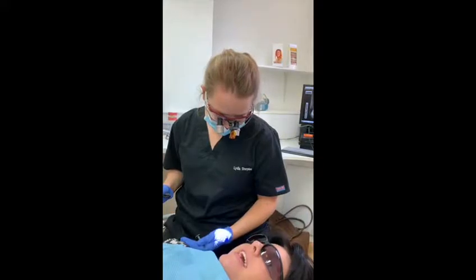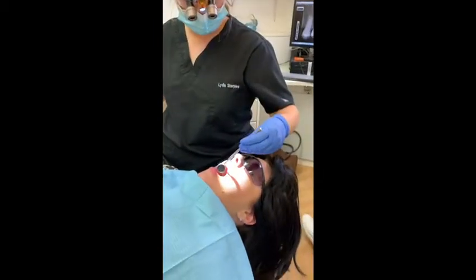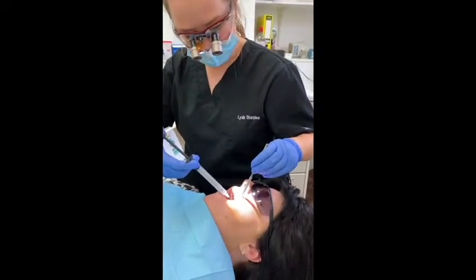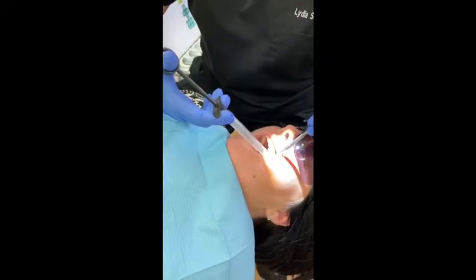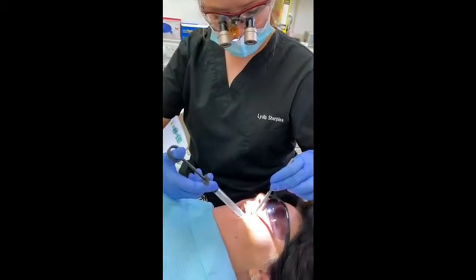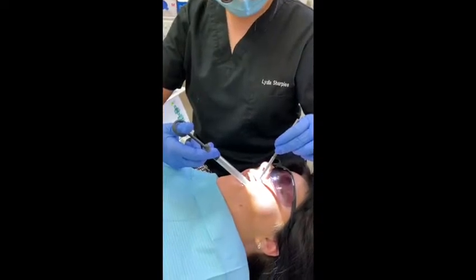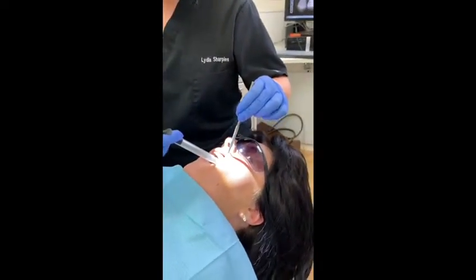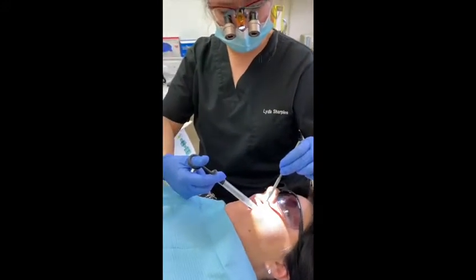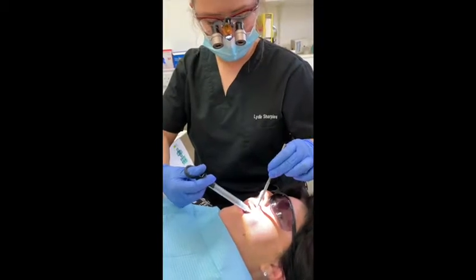So Amy, are you happy for me to pop this anaesthetic in for you? Absolutely. Are you comfortable? I am very comfortable. Brilliant. If you can open nice and wide and tip your head slightly towards me — that's great. Take a really nice deep breath in for me, and out. Well done Amy, that's really good. Take another nice deep breath in, and out. Take another nice deep breath and this time when you breathe out, really relax into the chair. That's great. Well done. Relax those shoulders for me. Fantastic.